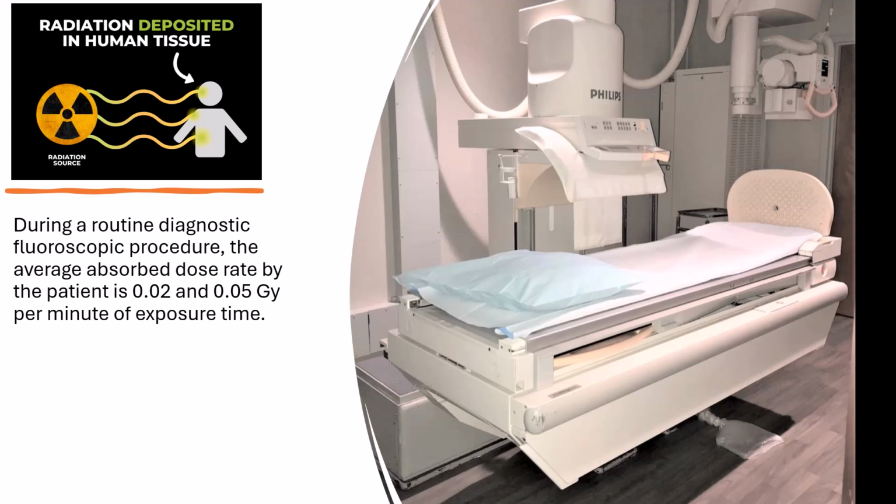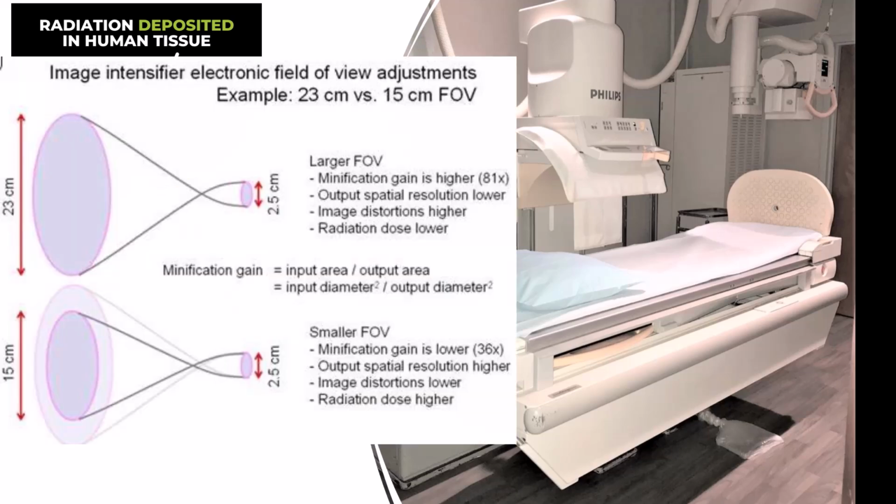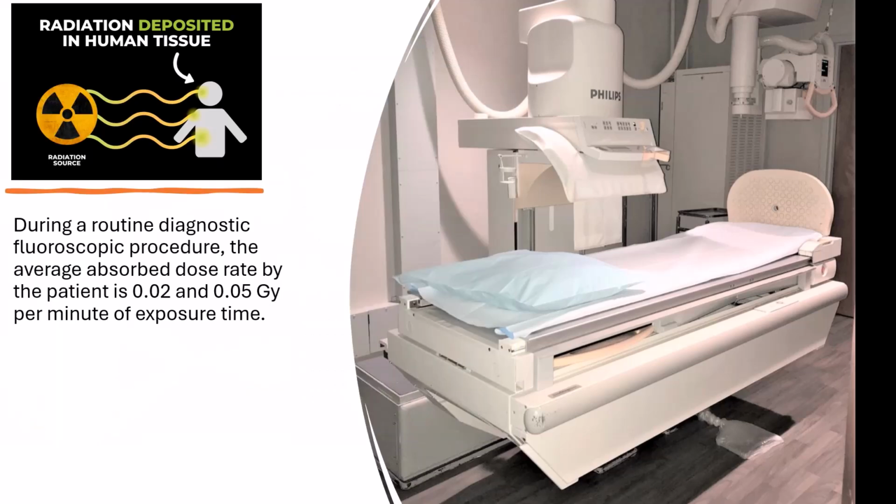The average patient exposure during a diagnostic fluoroscopic exam can vary dependent upon the procedure, the equipment being used, and the person doing the examination. It makes a difference what modes are used during the examination and the expertise of the individual doing the examination.